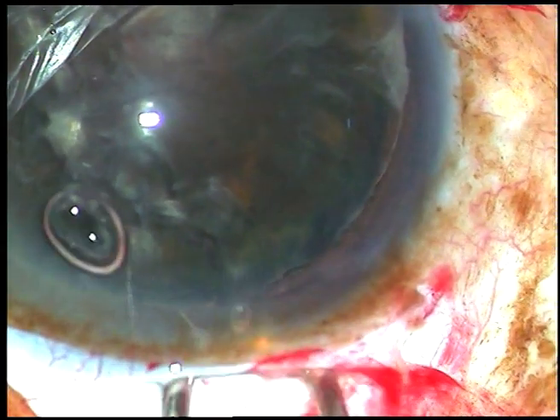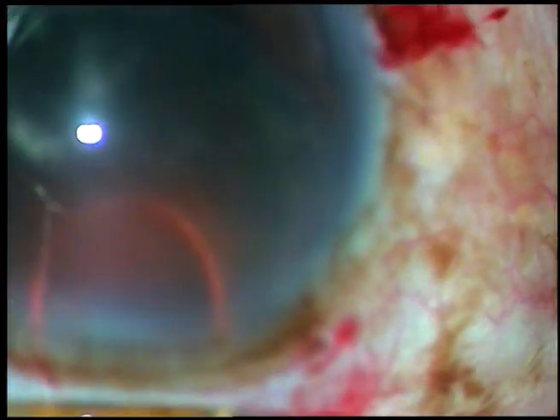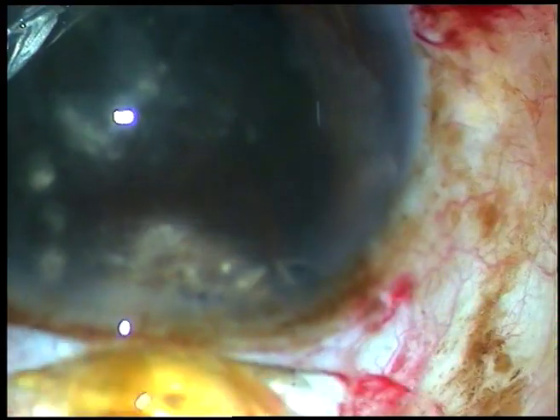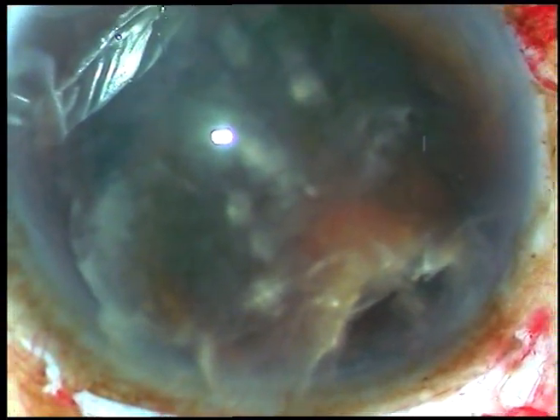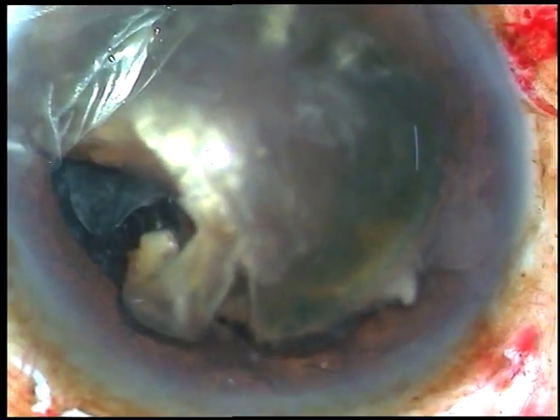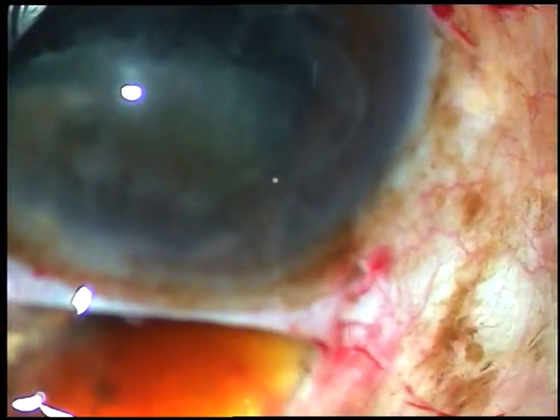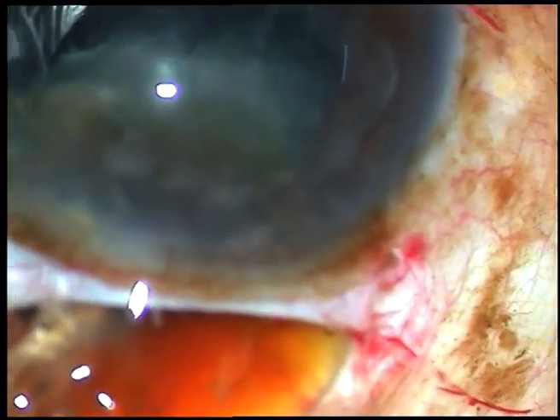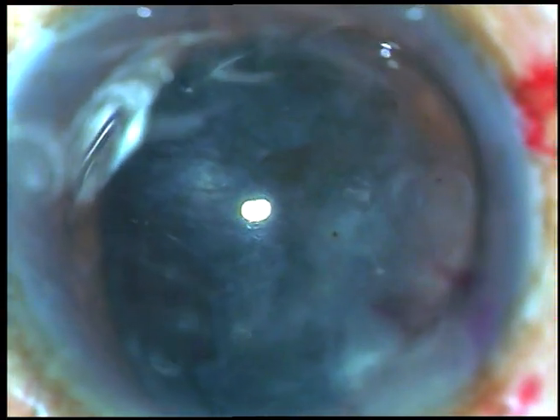Now I am going to use the irrigating vectis to break the nucleus in the section, because the nucleus is large and it is not going to come out whole. A small portion of the nucleus has been broken. Now the nucleus is aligned again so it can come out easily. One portion of the nucleus has come out, another portion remains in the anterior chamber. So I take a Sinski hook, rotate the nucleus and it has come out.